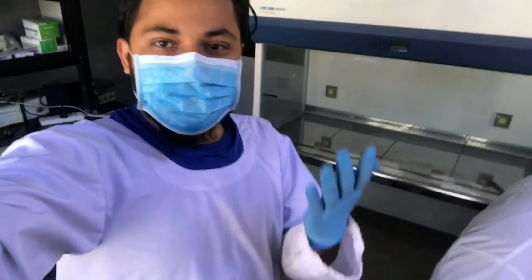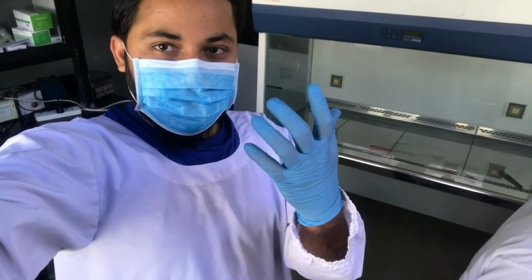So we are in the regional lab. We will be doing ELISA. For that, personal protection is very necessary. You can see we are fully protected, PPE, everything.